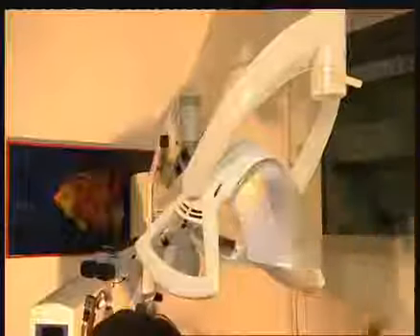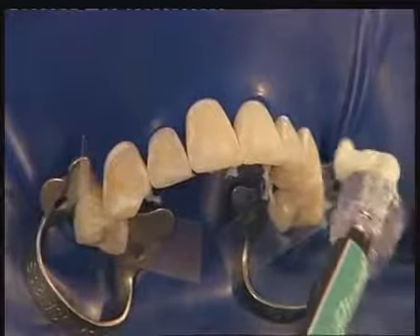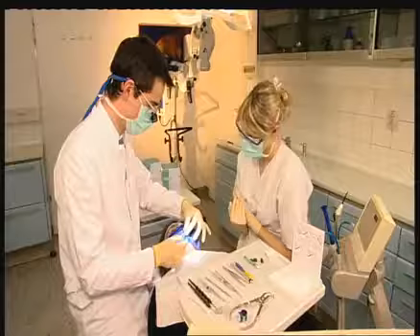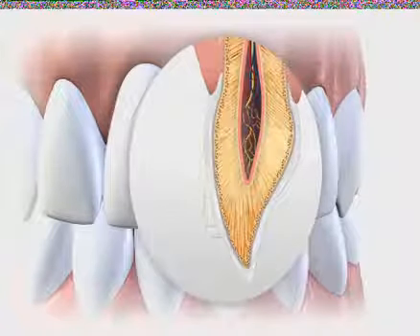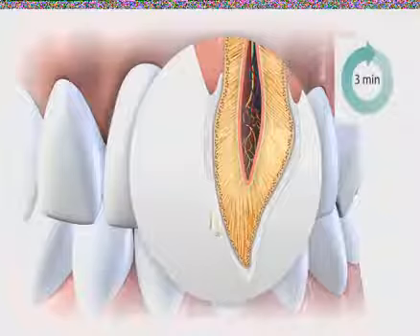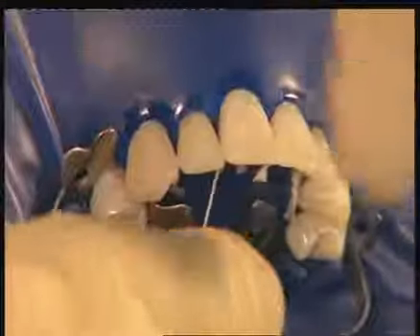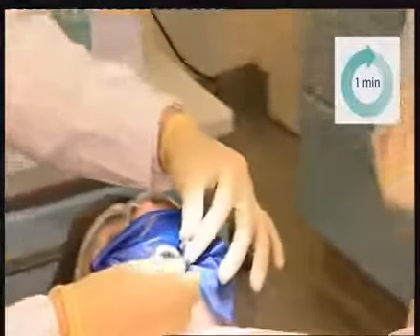The infiltration process begins by means of DMG's specially designed application tips, which allow access up to the cervical margin. The specifically developed resin is applied slowly to the affected area in two steps. The first application of infiltrant is allowed to penetrate deeply for a period of three minutes. Excess is removed with a cotton roll and dental floss, and then the resin is light cured. This process is repeated, whereby the second resin application is made for only one minute.